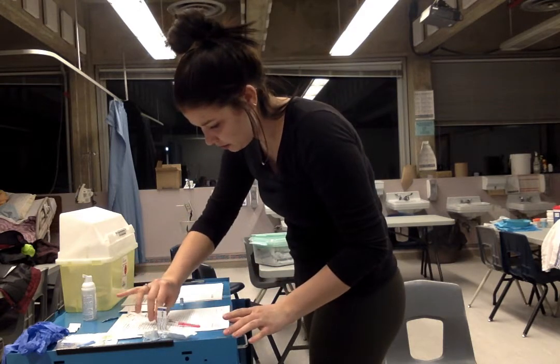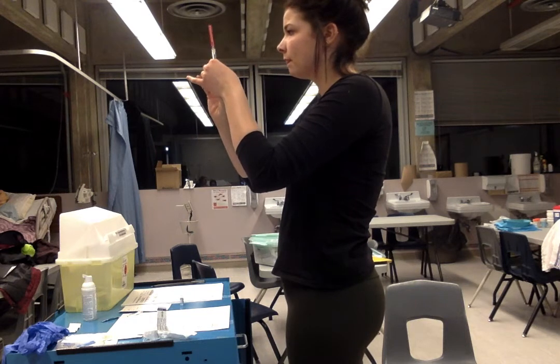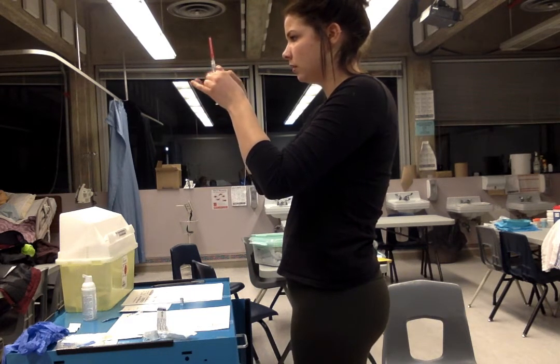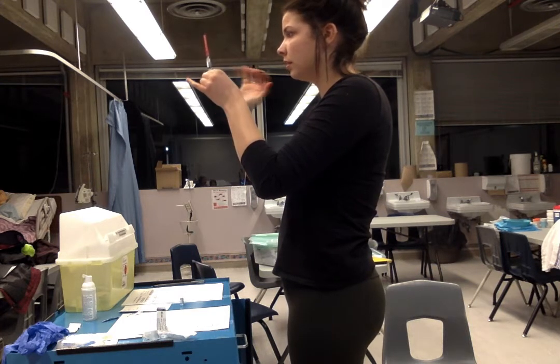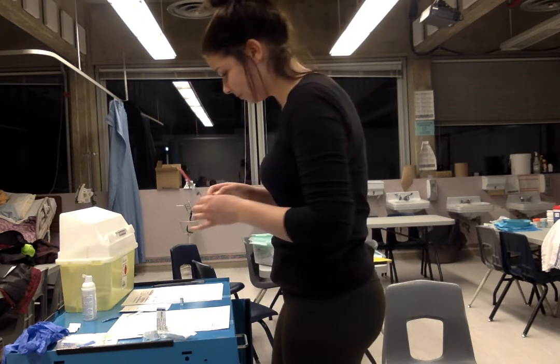I'm just going to cap so that I can get my bleb without spilling. And we got all the air up to the top. Okay, there we go. I see it up there. And we got 1 ml.